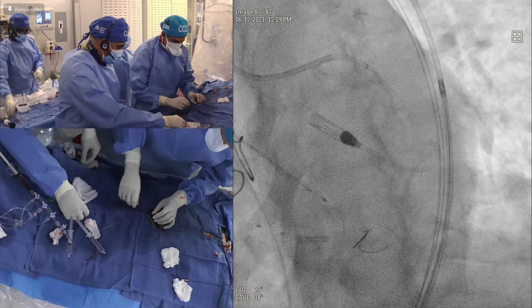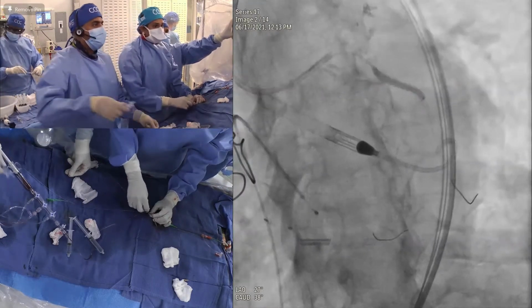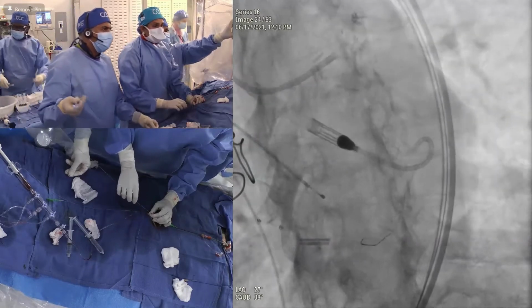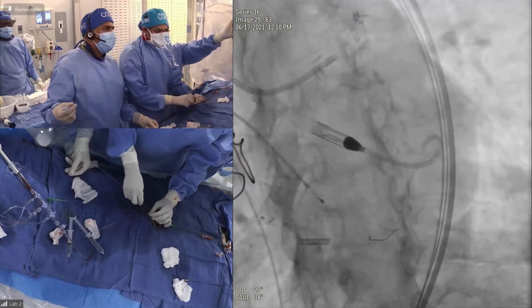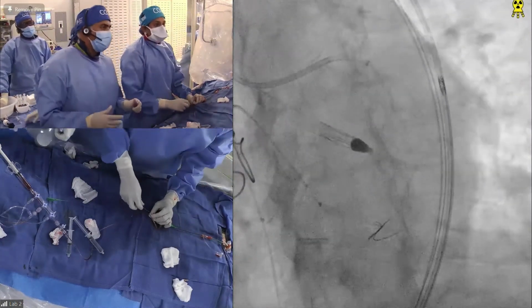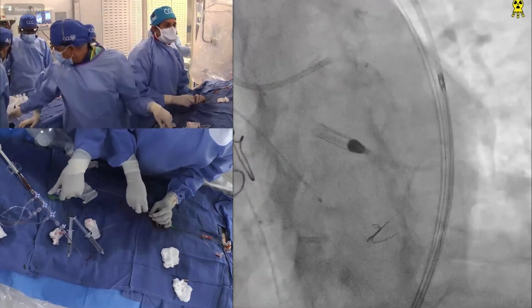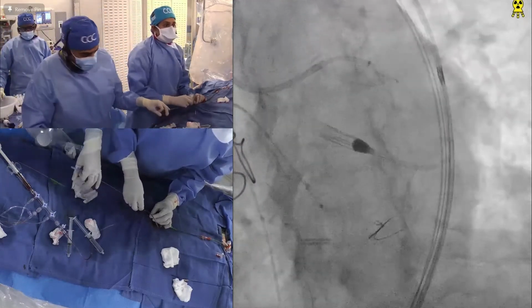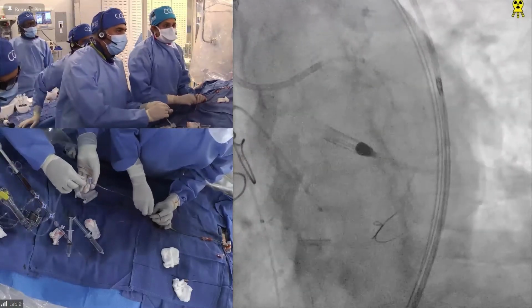Let's see what the audience asks. Maybe we can just show you, one second. Here, see that? Exactly where it originates. See, there is definitely a gutter dissection there. I created it. Exactly, approximately. Gutter, yes. The patient characteristics too: extremely elderly. We are ready with the 1.5 burr. And here you are now with both the guideliner and the wire in. That's the problem.